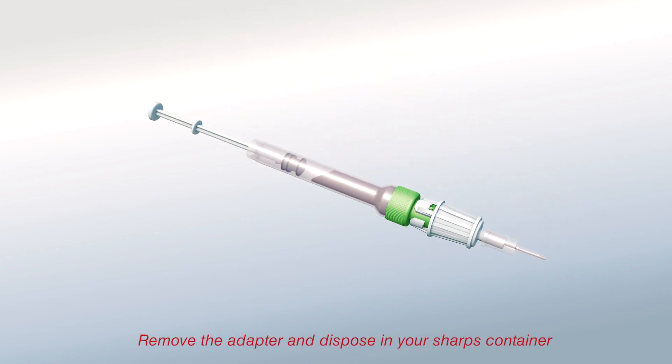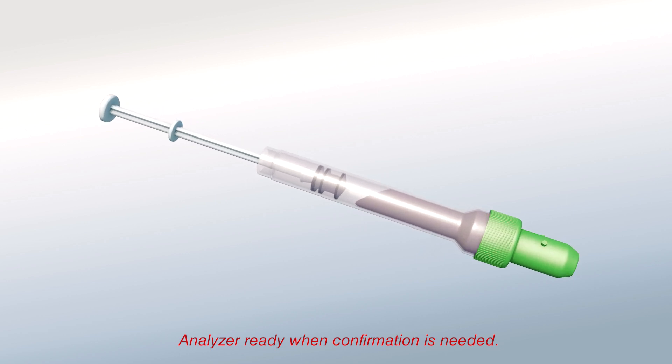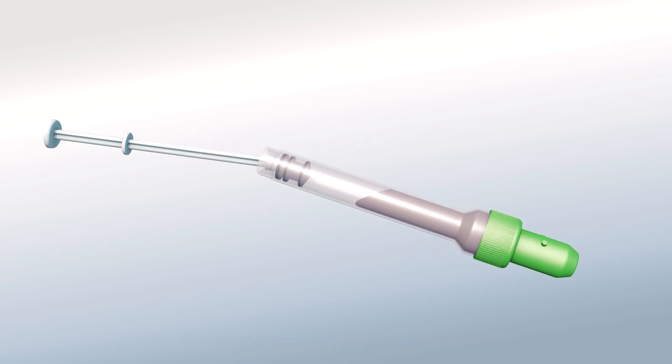When completed, remove the adapter and dispose in your sharps container. In cases where laboratory confirmation is needed, the Monovet can be made analyzer ready by locking the piston into the base with an audible click. Then, snap the piston off.